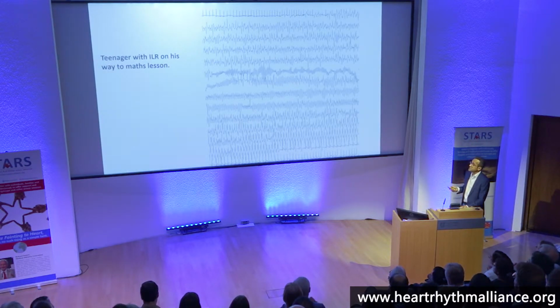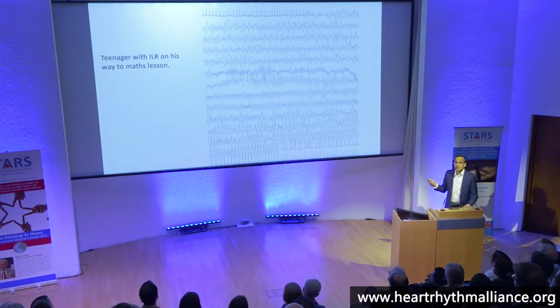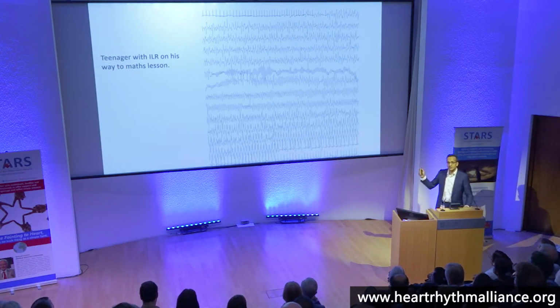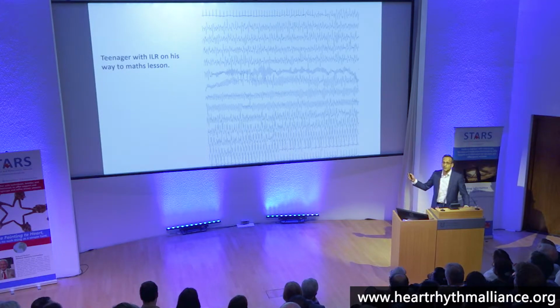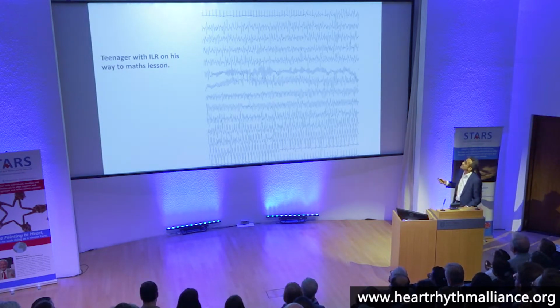This is a young teenager on the way to his math lesson, loop recorder download. The pediatric team were investigating for a long, long time, okay? He had a ream of negative investigations, always fainted out in the community, always at school or in times of sport, okay? Sinus rhythm, 2 morphologies of ventricular tachycardia, and then VF. Okay, then he made his lesson. Probably didn't do his homework.